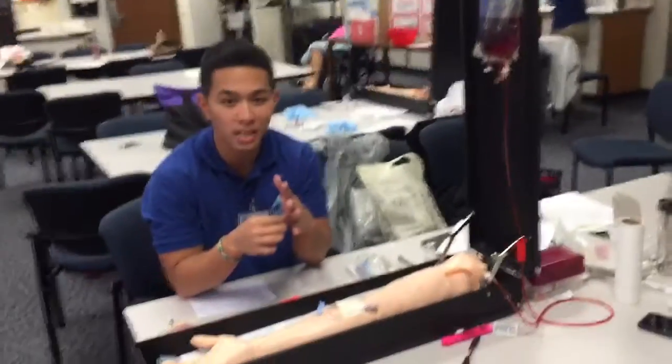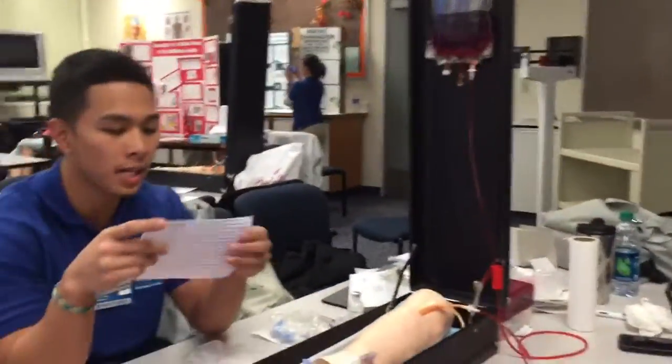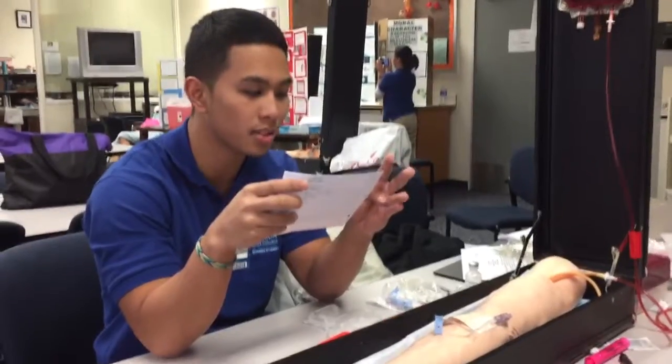Alright, today we're going to be hanging a mini bag. We're going to administer the medication through the IV and add the medication into the mini bag. So the first thing we're going to do is check the physician's orders and the MAR, which are right here. For the patient, the doctor has ordered Flagyl, IV 500 milligrams every 6 hours.